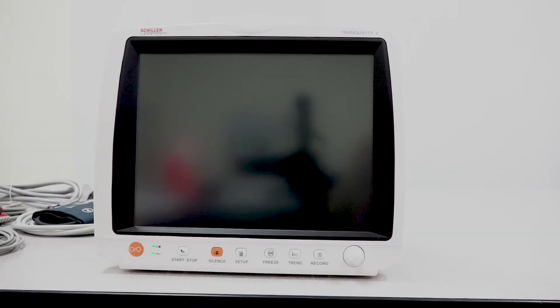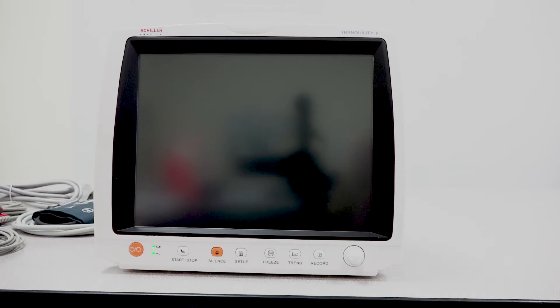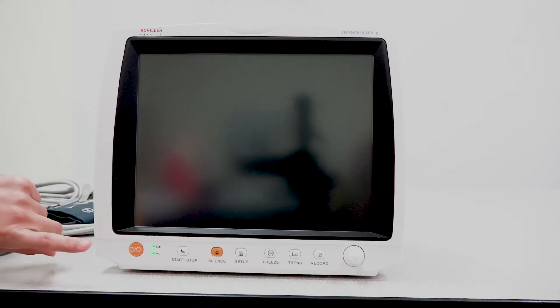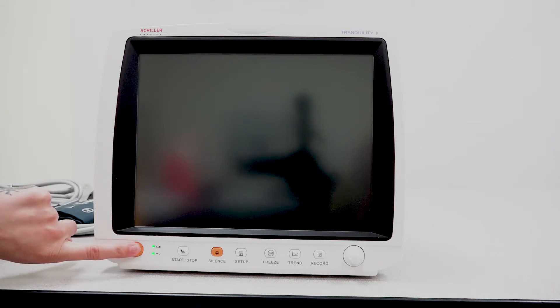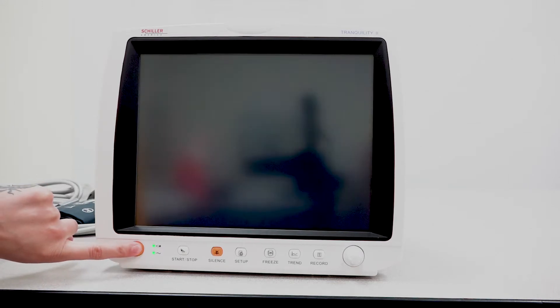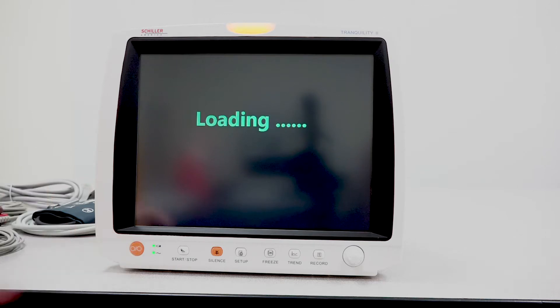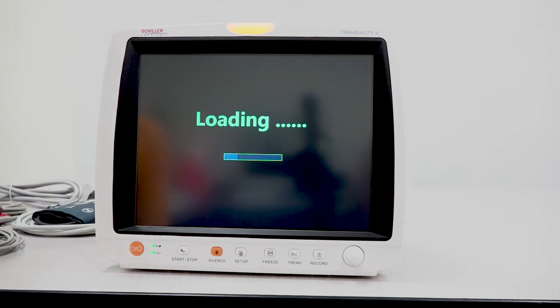Hello everyone, in this video I would like to demonstrate the basic functions of the Tranquility 2 monitor. Let's go ahead and begin by pressing the power button. Please hold down for at least 2 to 3 seconds so that the unit can power up.